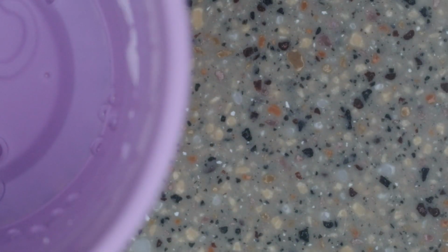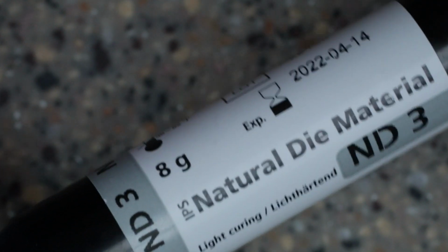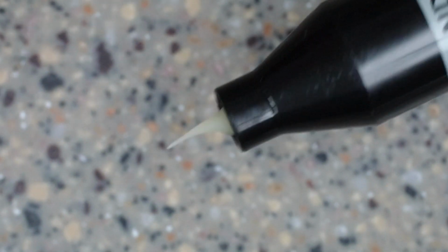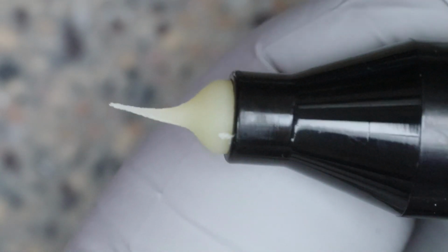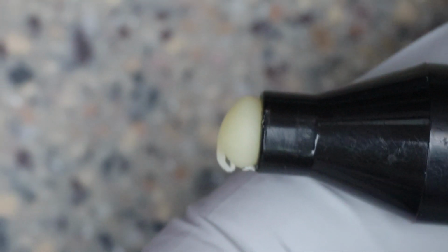So this Natural Die kit comes with these different types of composites, right? These different types of materials. Here's an ND3, so that corresponds to a specific shade on that shade guide. And then you'll see here, this is a twist syringe, but this material is basically just like composite, very similar. I've already got some out, so I'm going to use that. I'll put this back up.